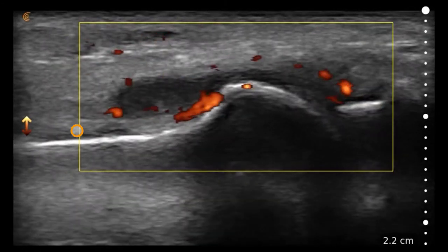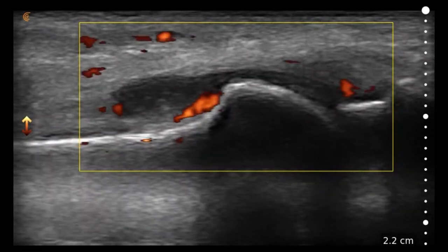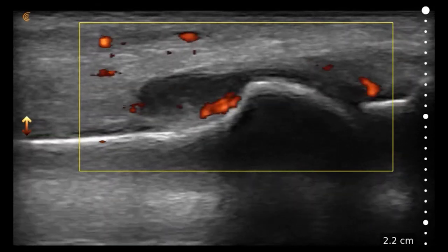These findings represent, given the anatomic location, most likely gouty arthropathy, but other diagnoses should be entertained, including a potential septic joint or other causes of an inflammatory arthritis.